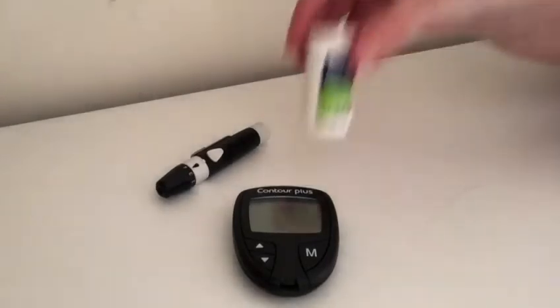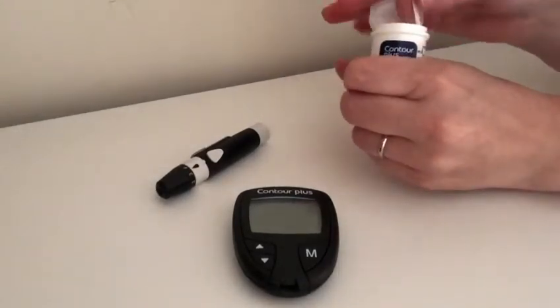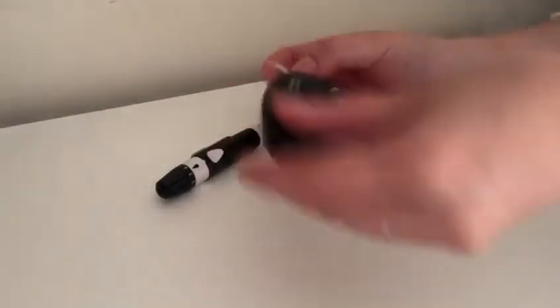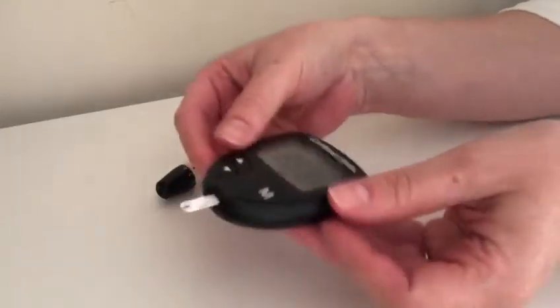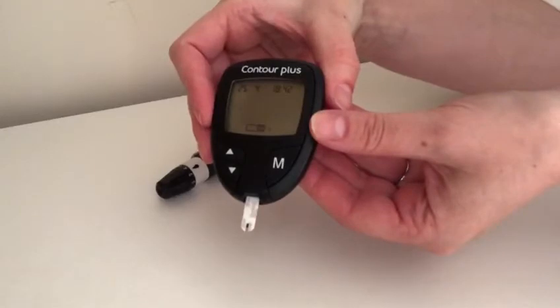To test your blood glucose, open the pot of strips and take one out. Make sure you shut the pot properly to keep the strips airtight. Push the strip into the bottom of the machine into the slot — this will turn the meter on. When the meter is ready for you to apply blood to the strip, you will see a little flashing icon.